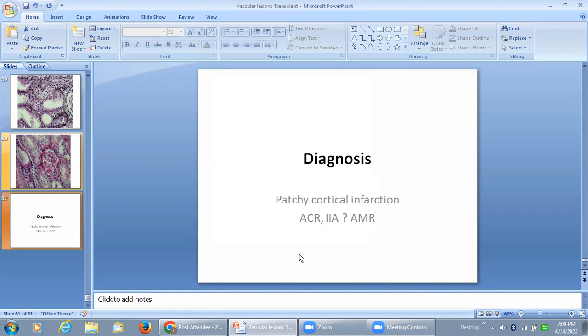Okay. How much is the percentage? I'm not very sure. It could be maybe 4-5%. I'm not very sure about that because I don't look at the immunopathology part. I look at only the histopathology part of renal transplant. But yes, we have seen cases where morphologically I'm sure that it is acute AMR, they get the single antigen bead assay, but not very common.